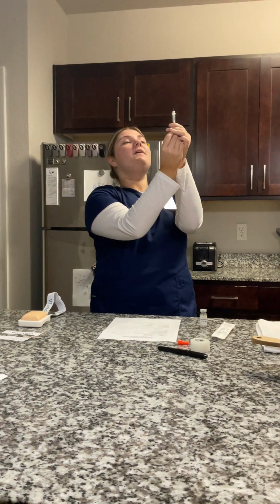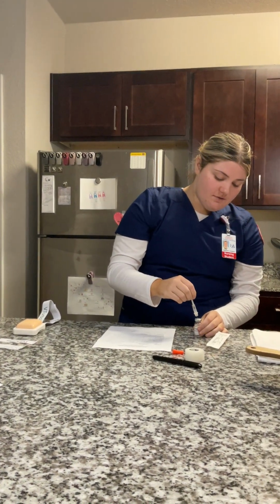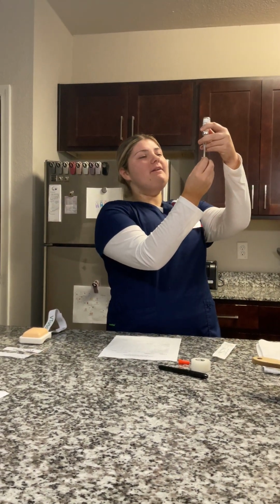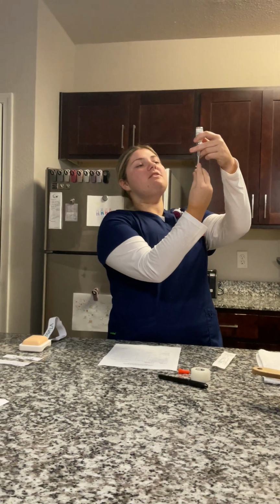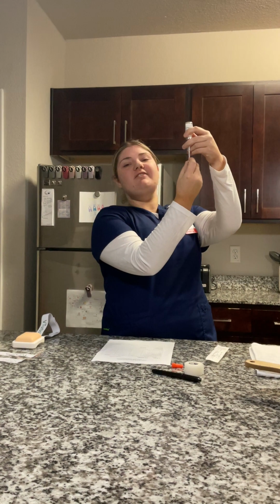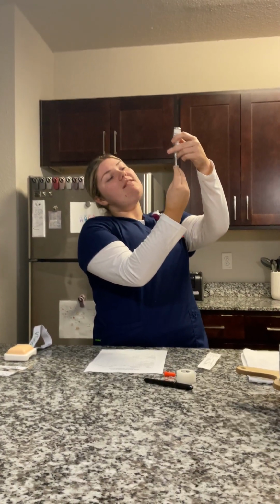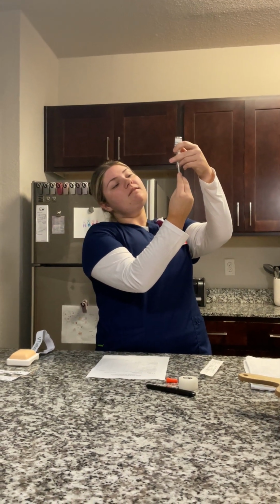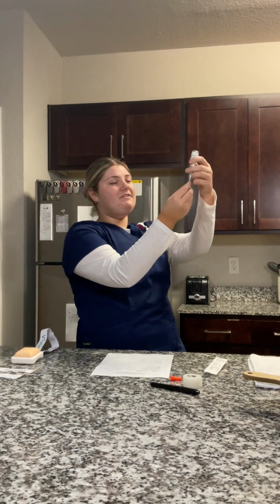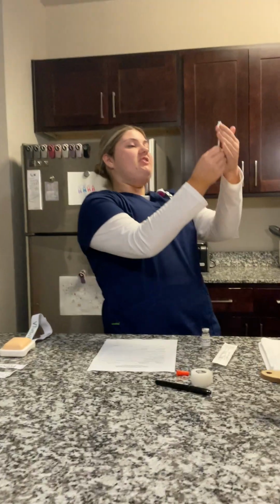Whoops, it's kind of hard to see with that thing. Okay, and now I'm going to inject my needle into the vial and flip it upside down. Now I'm going to take a little bit more than 10 units and push it back in just in case there's any air bubbles or anything like that. I forgot to say I pushed the air in before, but then I get exactly 10 units in, and then I'm going to take this off and check.